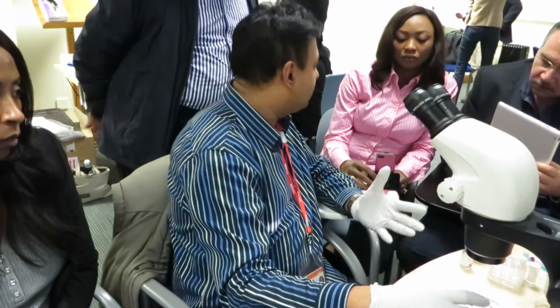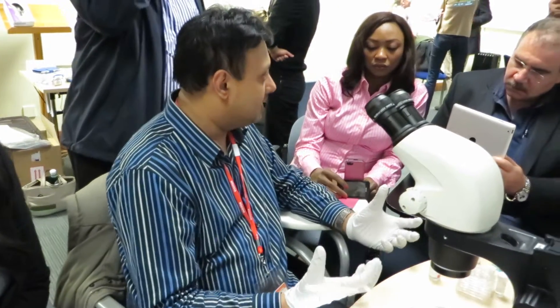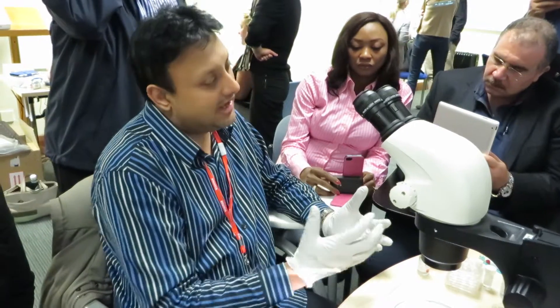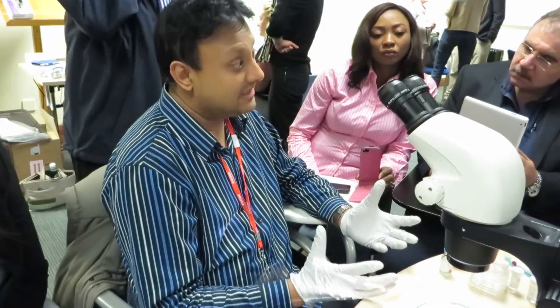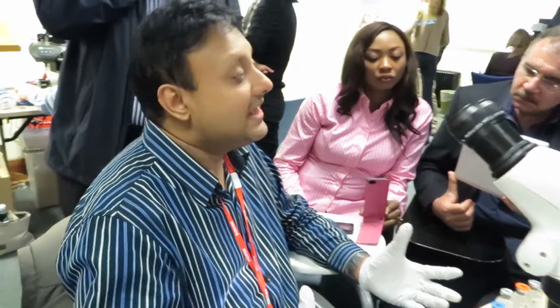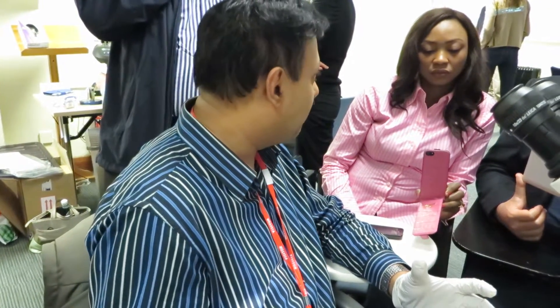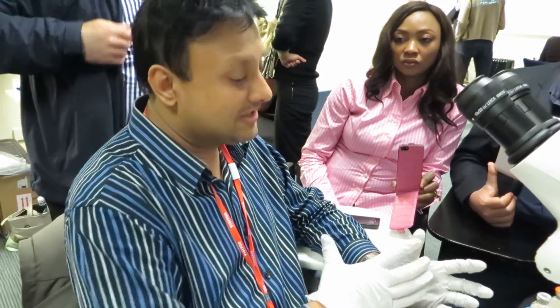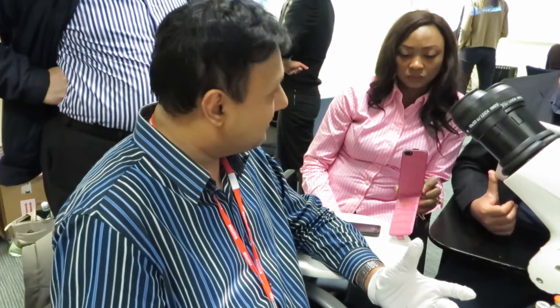We're going to be vitrifying some blastocysts now. Once we have biopsied blastocysts for PGS, the next step is vitrifying them. With day 5 blastocysts there is an option of doing a day 6 transfer, whereas with day 6 blastocysts when you biopsy them the only option is vitrification. It's quite important that you have a solid vitrification program in your clinic if you want to consider doing PGS and trophectoderm biopsy, because this whole process has to be optimized in order to get good outcomes.